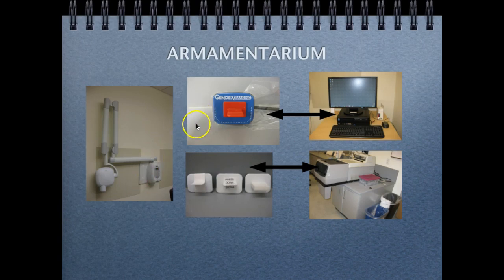Then we need to have some kind of image receptor. So this is a digital sensor. Then you will need to have a computer program in order to see the images. And this is really the state of the art. This is current technology that's used in dental practices.